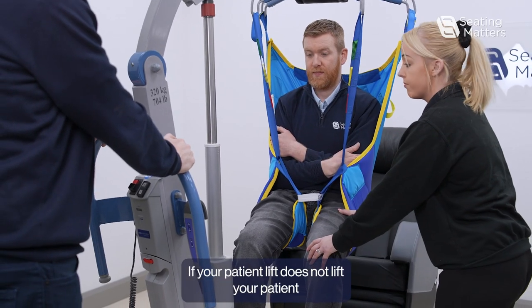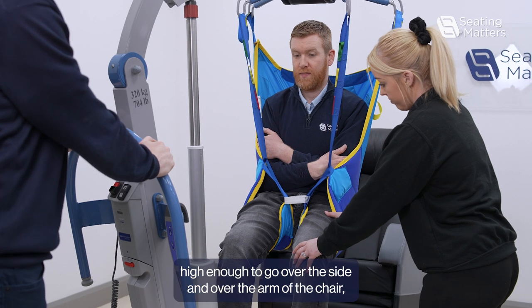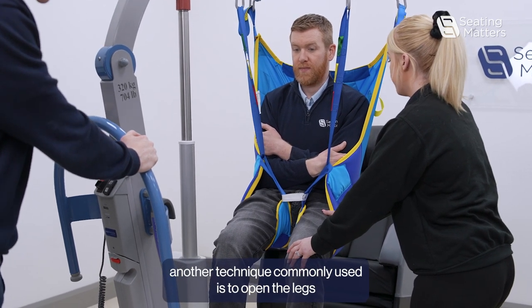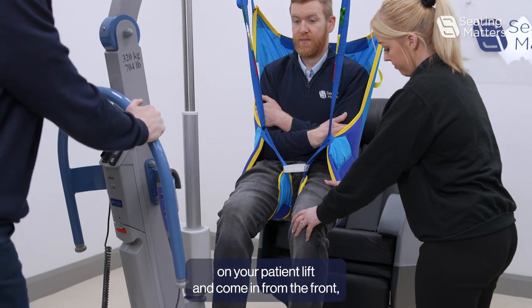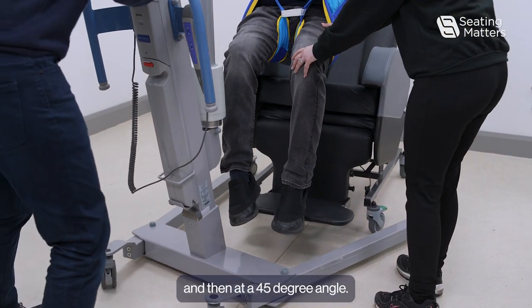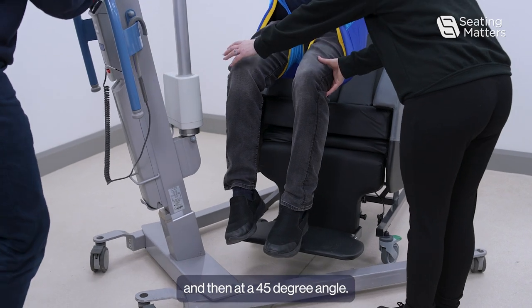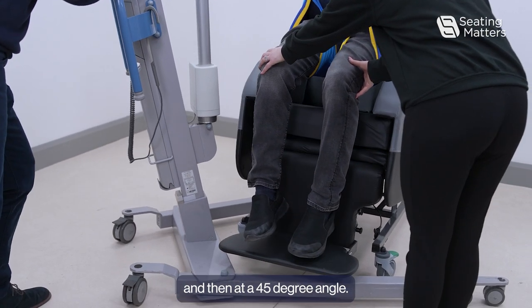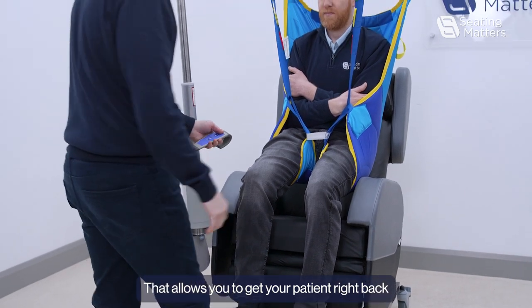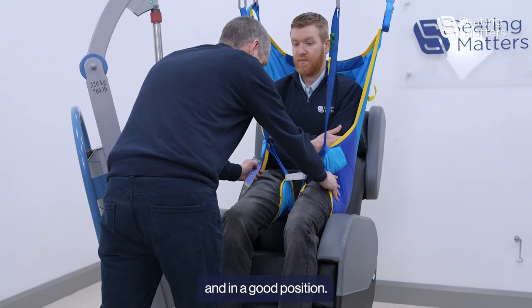If your patient lift does not lift your patient high enough to go over the side and over the arm of the chair, another technique commonly used is to open the legs on your patient lift and come in from the front and then at a 45 degree angle. That allows you to get your patient right back and in a good position.